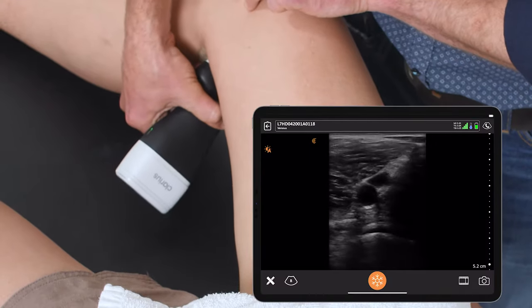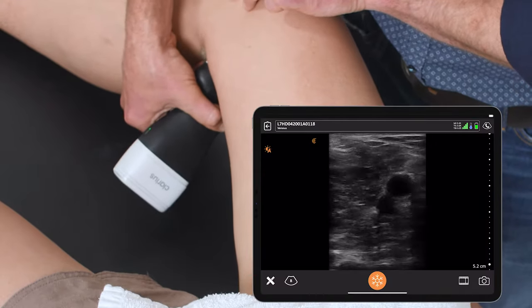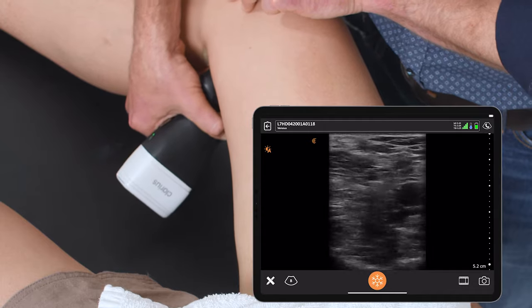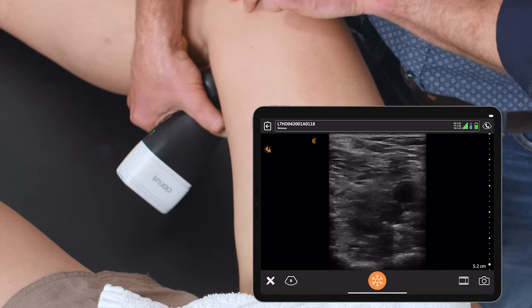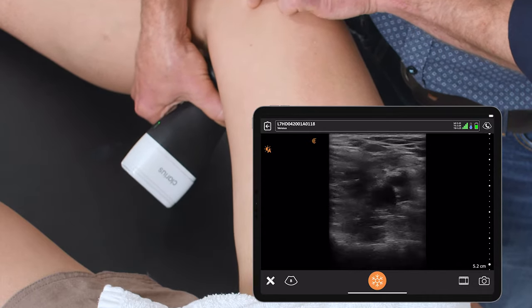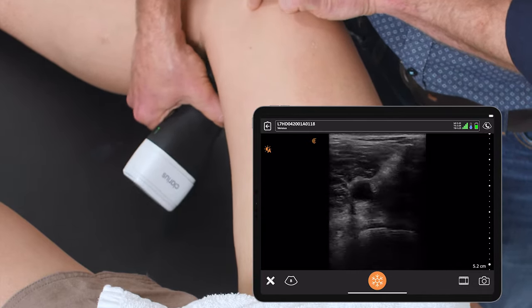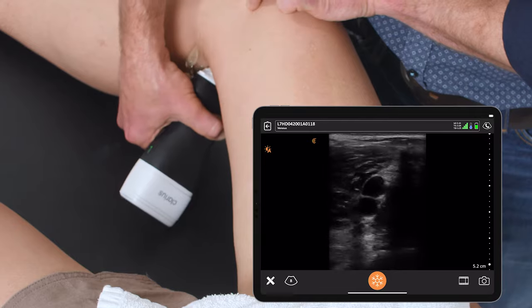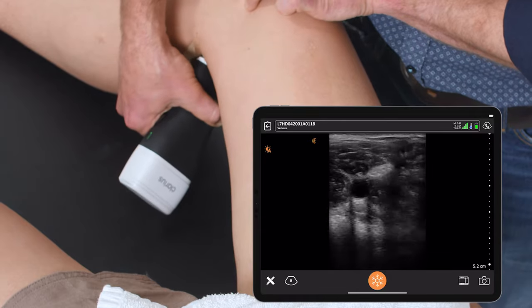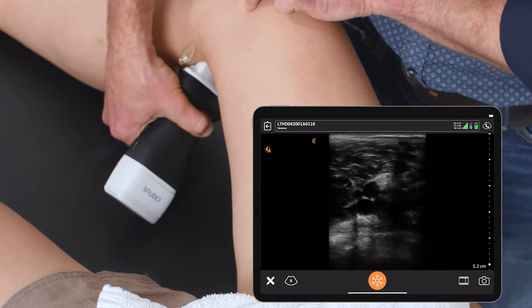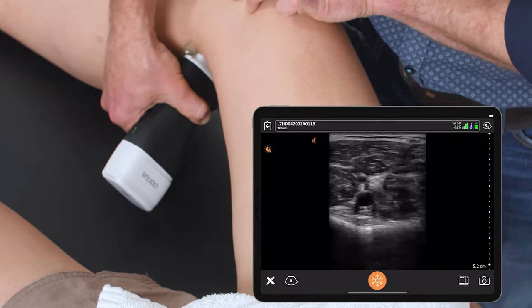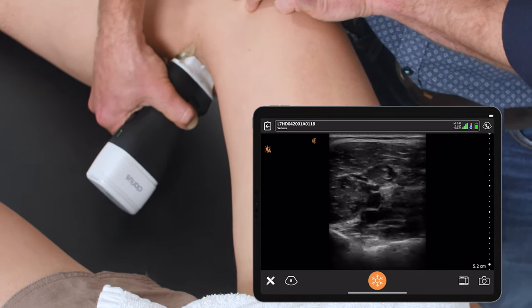Here I'm going to identify the popliteal vein at its most proximal aspect, and repeat compressions all the way down the popliteal fossa until it trifurcates into the calf veins.